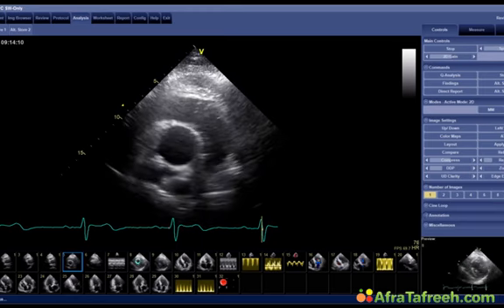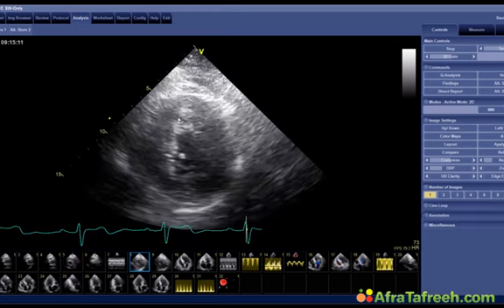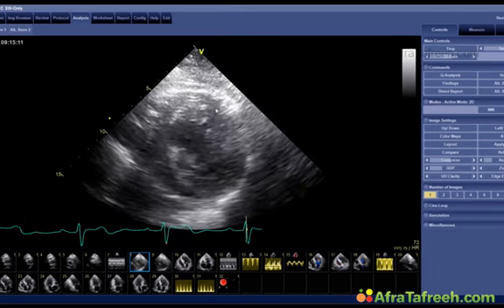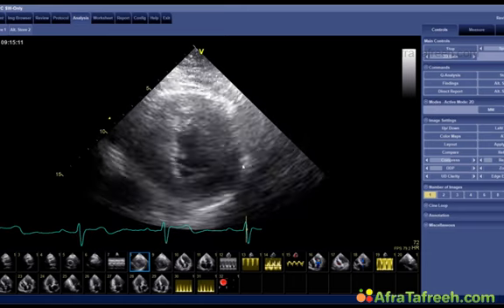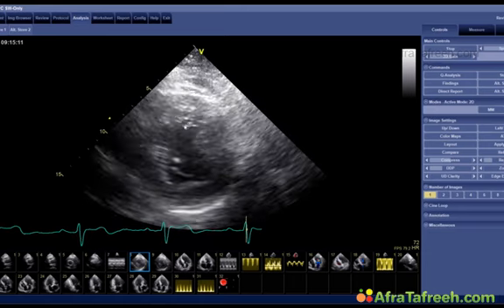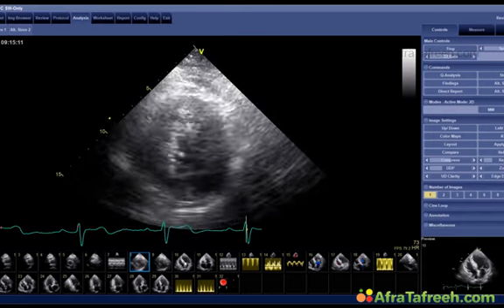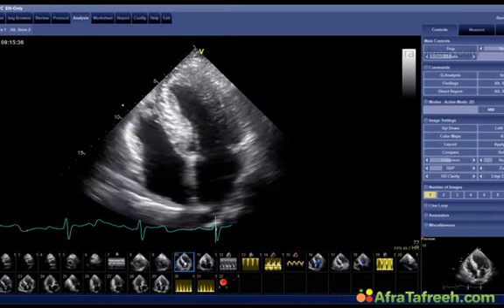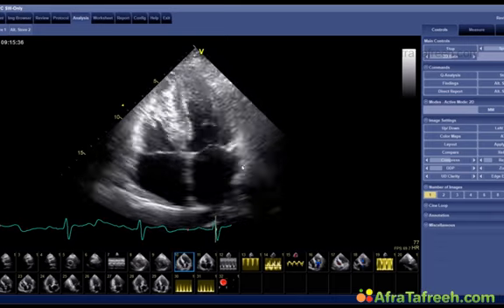Now, here is a short axis view of the left ventricle. Take a look at that. I'll be asking you a question later. Of course, there's left ventricular hypertrophy. There's no pericardial effusion. Take a look at its left ventricular function. Here's the apical four-chamber view.